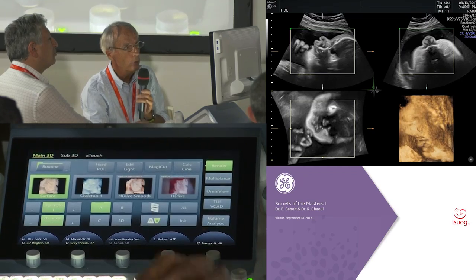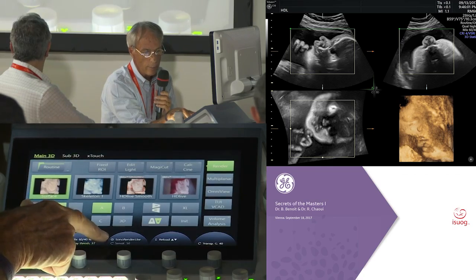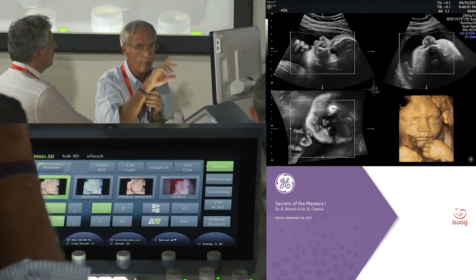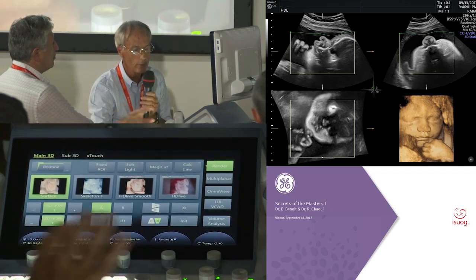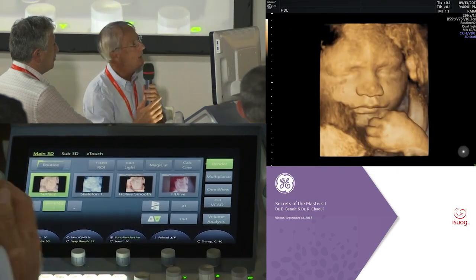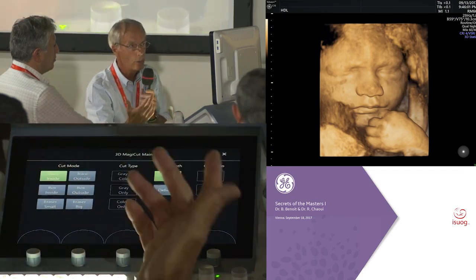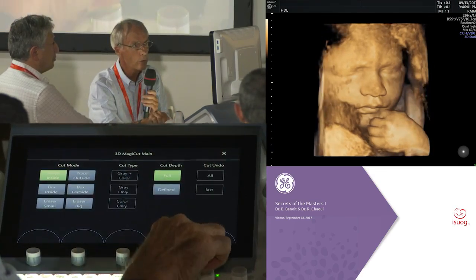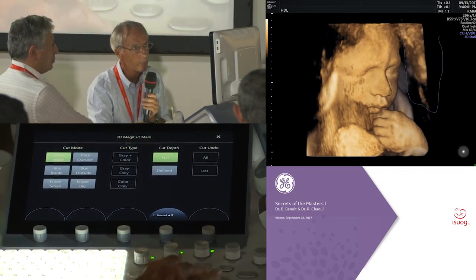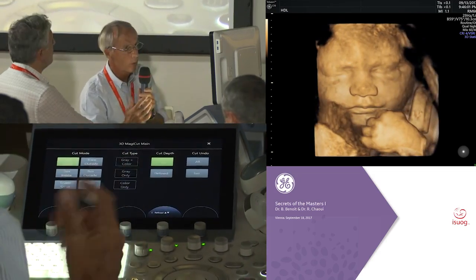But also, you can edit this line, or you can do it automatically. Here, the name is Sono Render Live. You just have to click on it, and the computer will find exactly the correct position. This is really fast, and this is the result. And you can clean a little bit more if you use Magic Cut. With Magic Cut, you just have to rotate, and here we remove this part. Okay? So this is render mode with a sepia color.